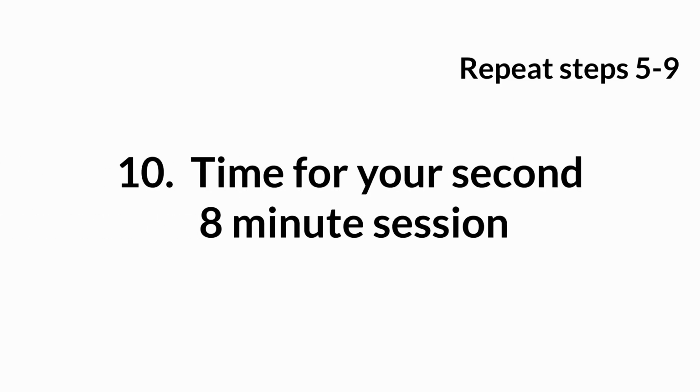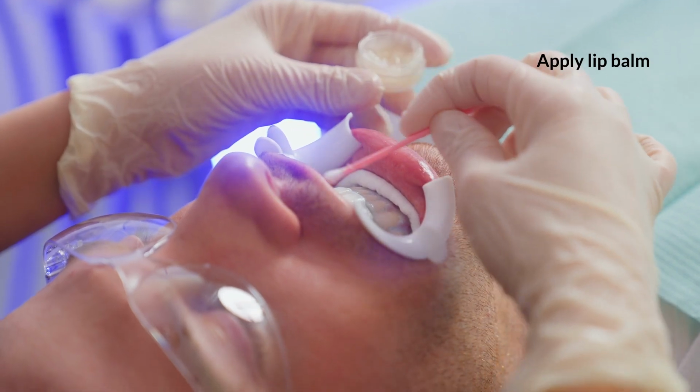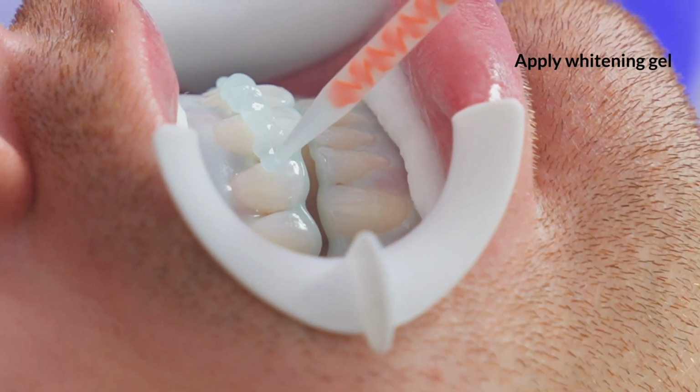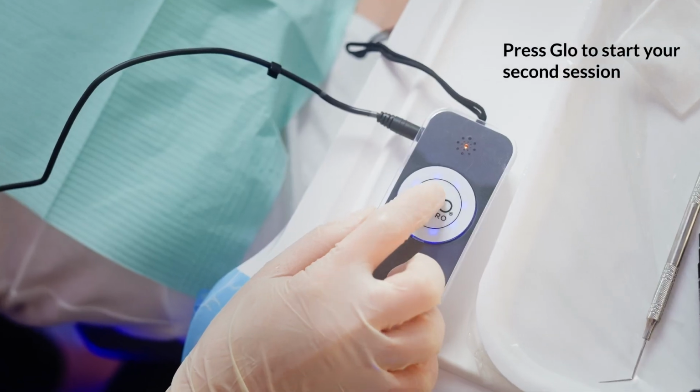Step 10. Time for your next 8-minute session. Repeat steps 5 through 9. Remember, lips should not come into contact with the mouthpiece or the whitening gel. Press GLO button to start your second whitening session.